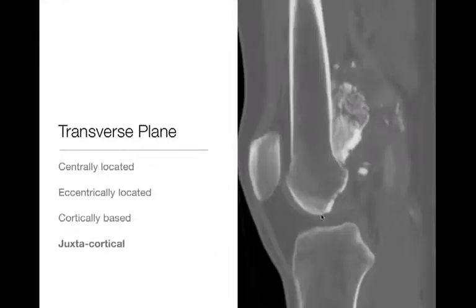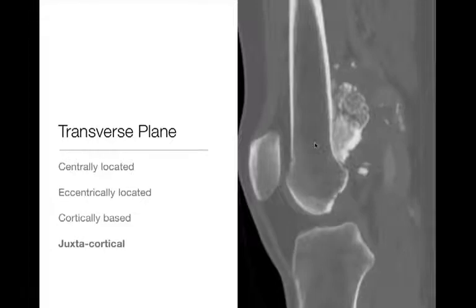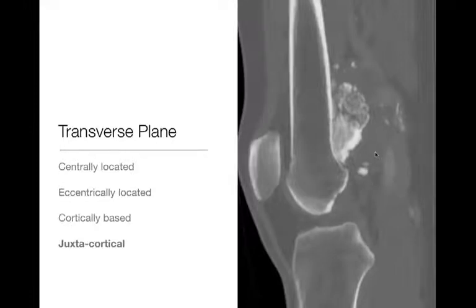Next is juxtacortical. By juxtacortical, we mean the tumor is arising next to the cortex — the cortex itself is preserved and the medullary space is preserved. Things that do this include periosteal osteosarcoma or juxtacortical chondroma. As you can see on the CT scan, the cortex — the thick sclerotic line right here — is right up next to the tumor. The medullary space does not appear involved, and there is a dense osteoid matrix with a soft tissue component. This is a classic example of a parosteal osteosarcoma in a juxtacortical location, a favorite spot being the distal femur.